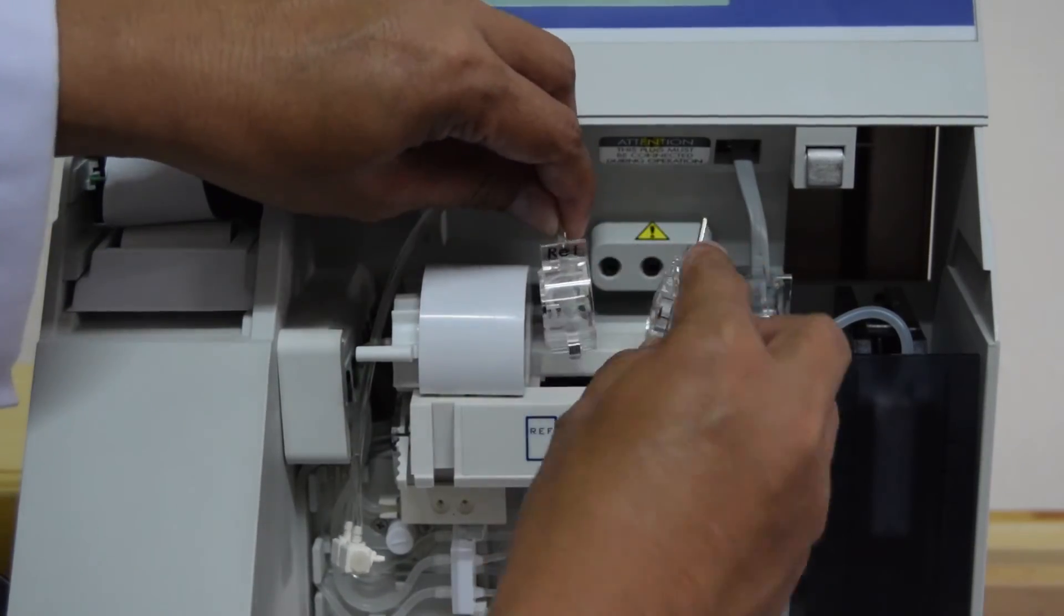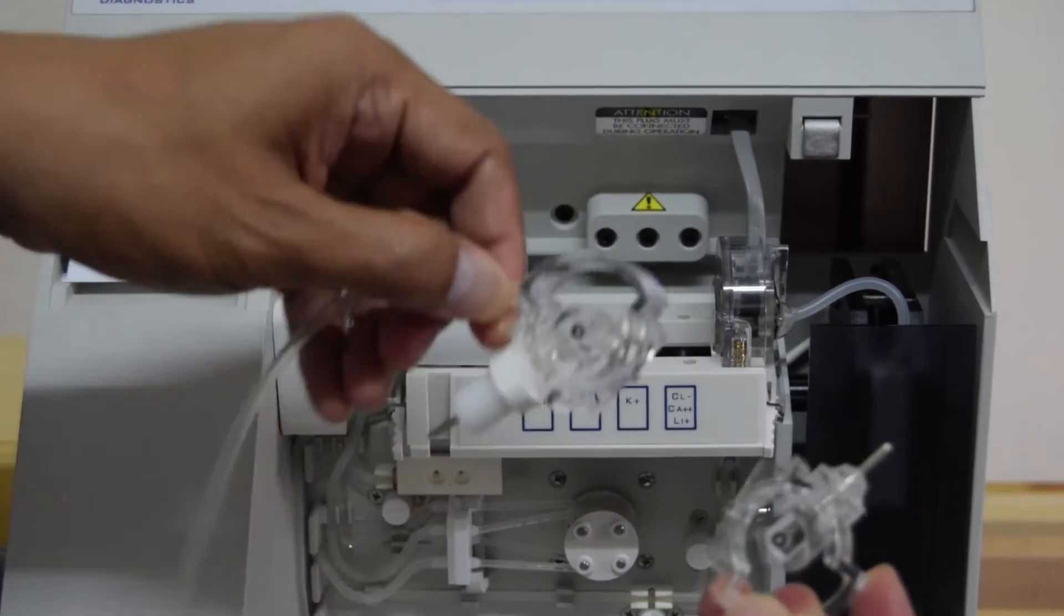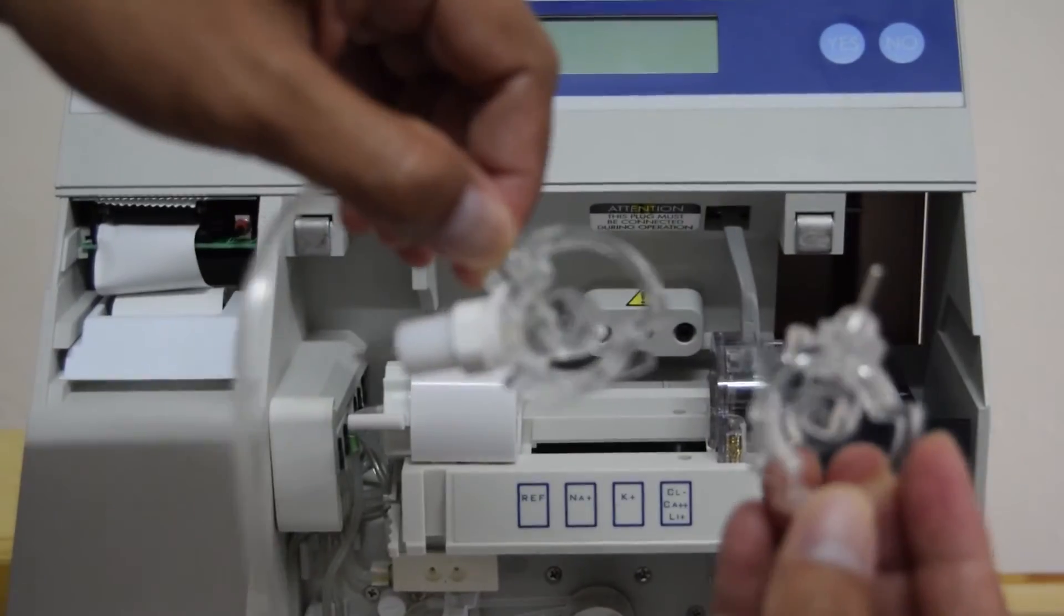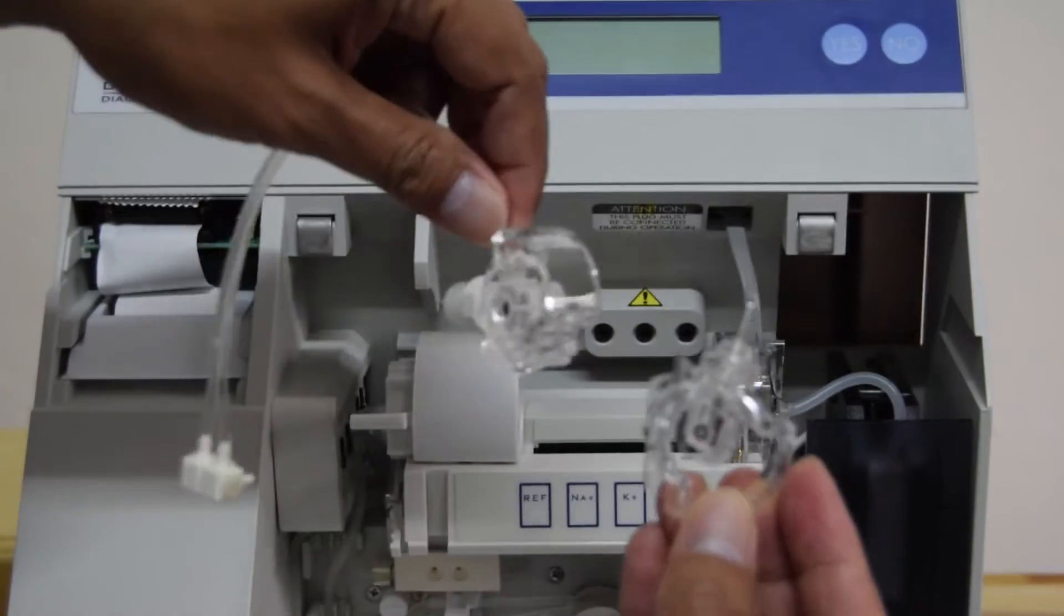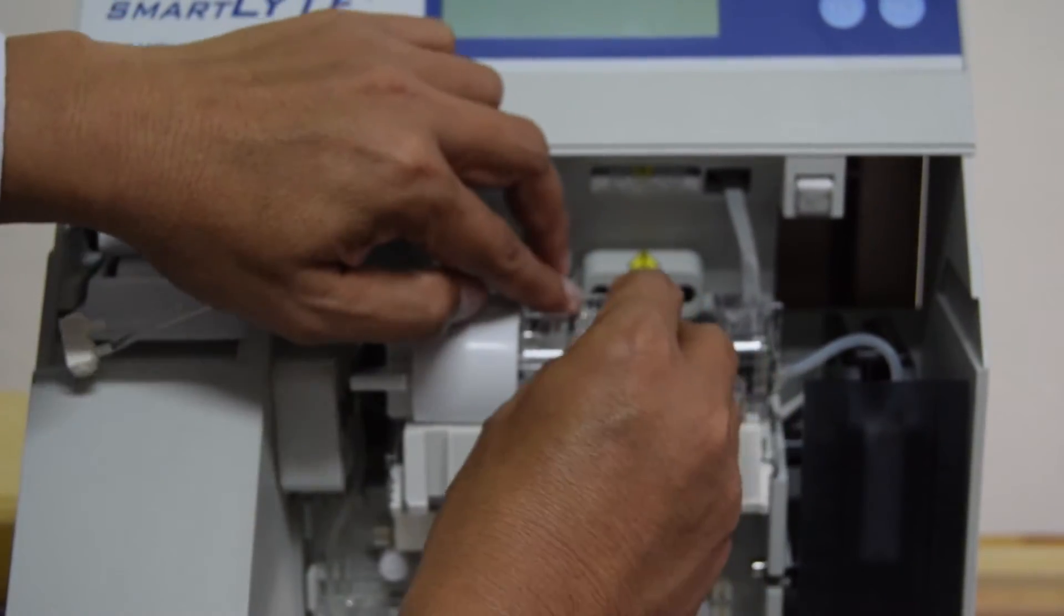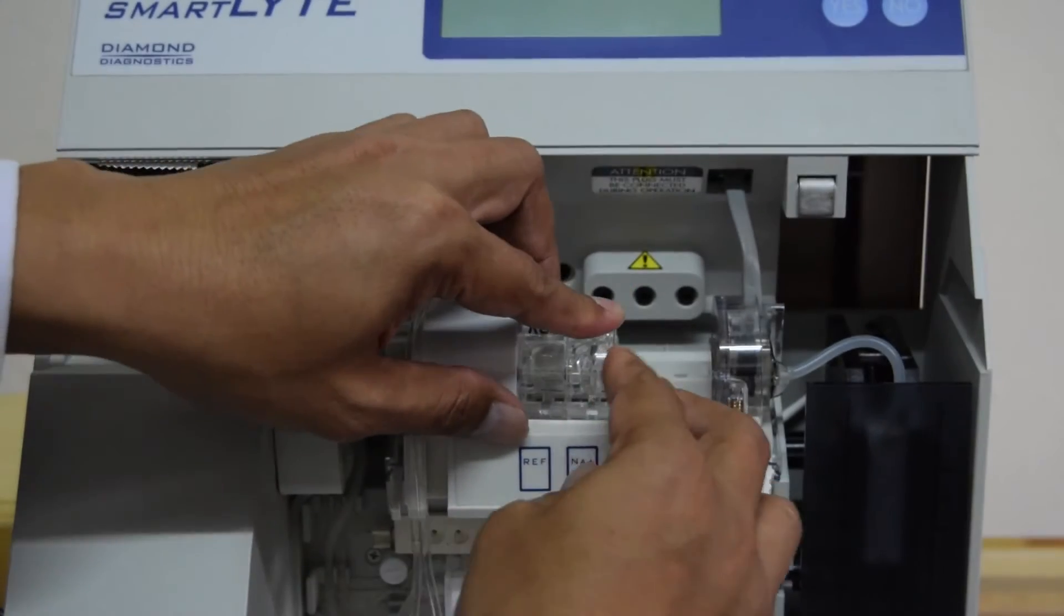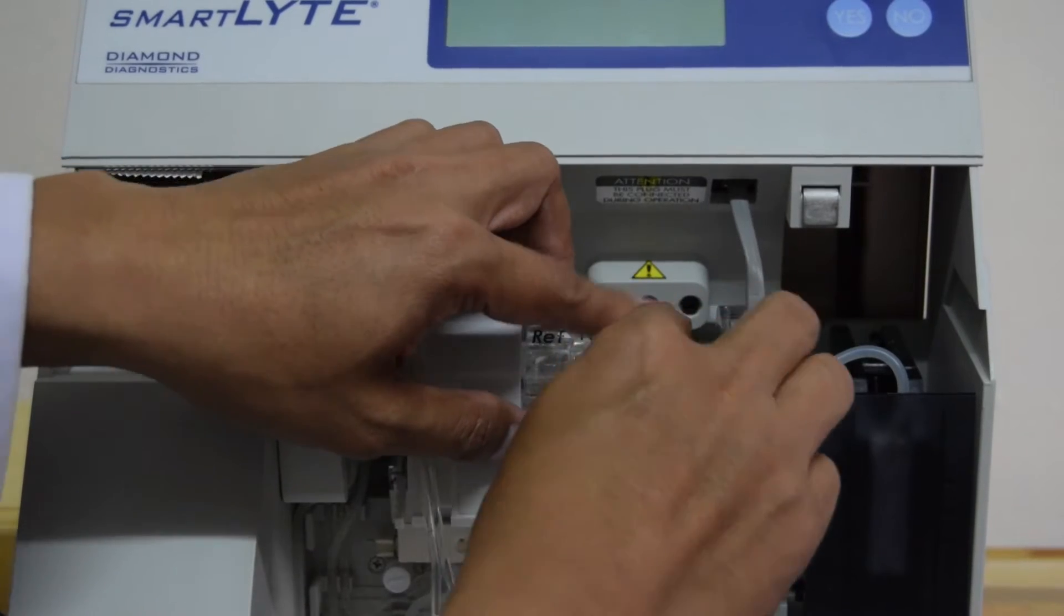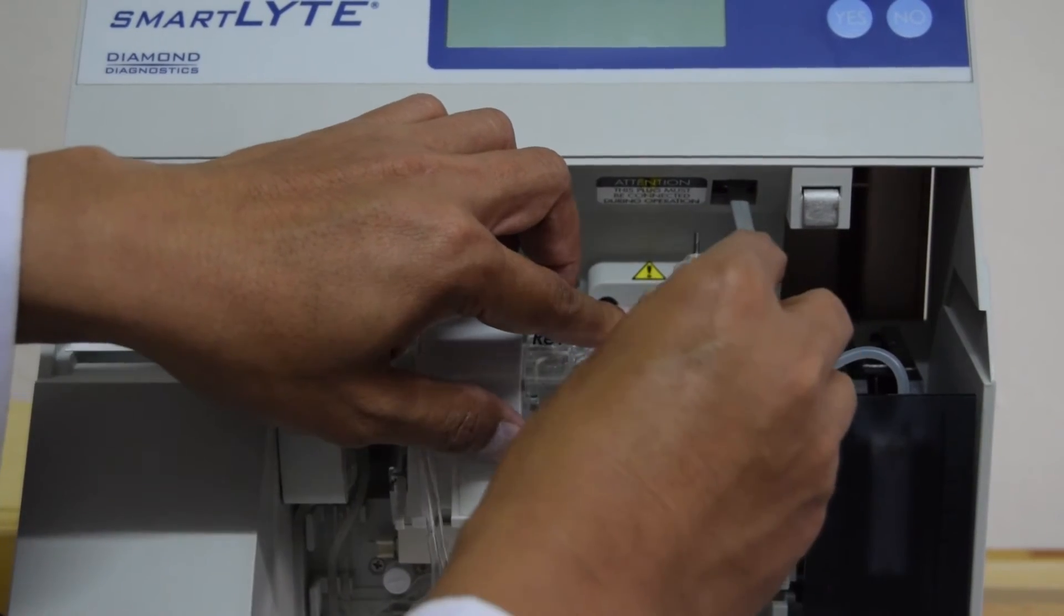Bisa dipasang sekaligus. Atau dipasang terpisah. Kalau dipasang terpisah, dimulai dari ref. Dari yang paling kiri. Sebelum dipasang, dipastikan dulu. Dipastikan bahwa O-ring pada bagian kiri dari elektroda ini semua ada dan terpasang. Seperti ini. Terus kalium. Dan kloride.